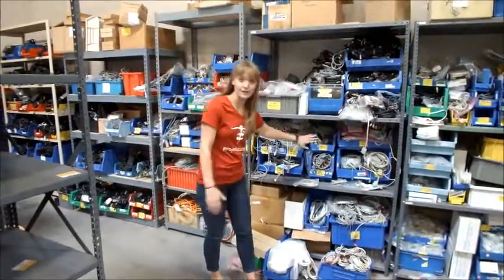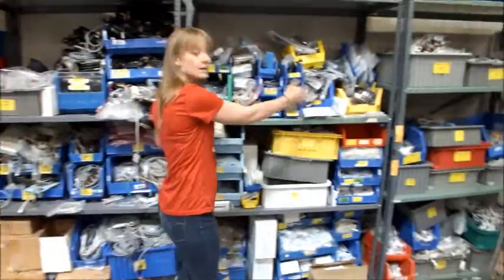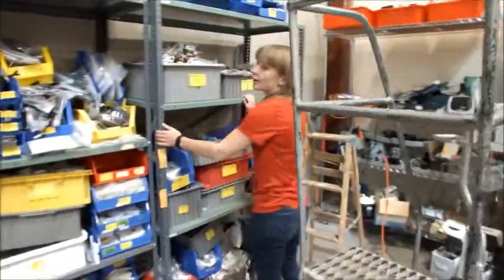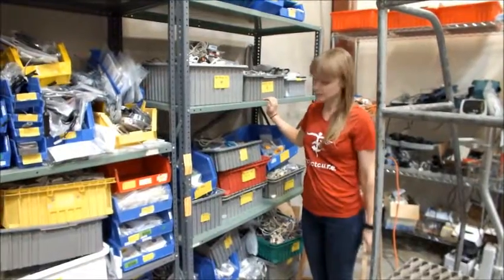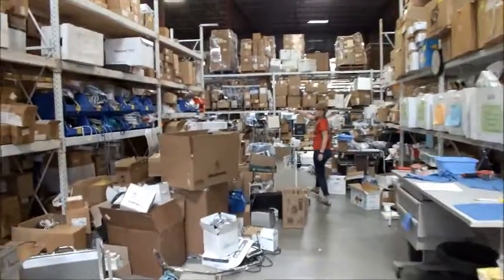Your electrode cords can be found in this area right here. Next to it are your temperature sensing cords. On the end right here are your SpO2 measurement cords and devices. Blood pressure cords can be found right over here.